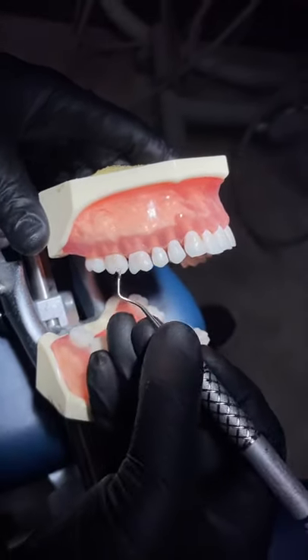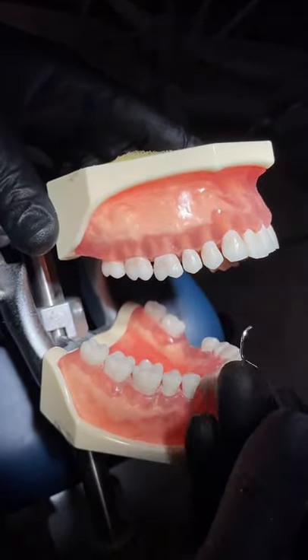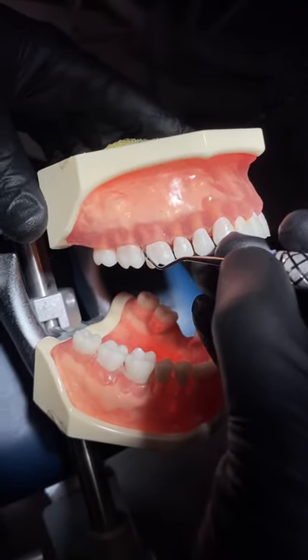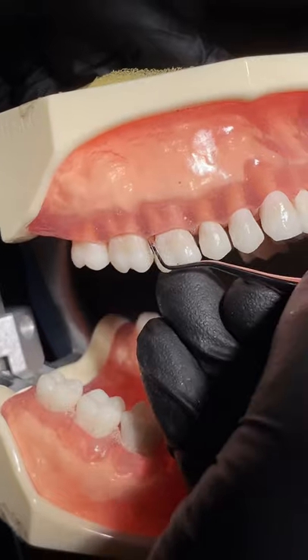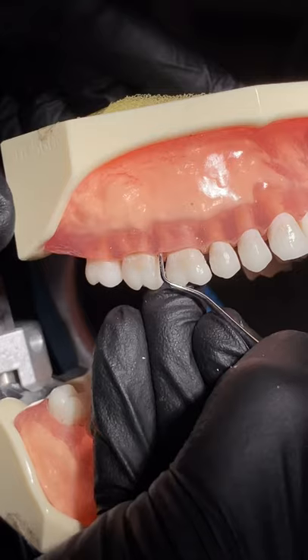In order to achieve proper angulation to insert our instrument subgingival, we're going to have to be between zero and 40 degrees. So on the distal we're going to have to completely close our blade and insert. Then we'll reopen the blade to instrument across the distal.